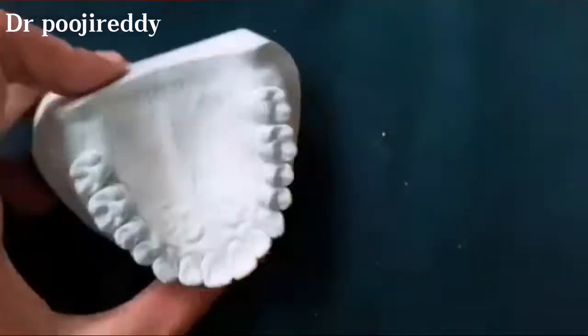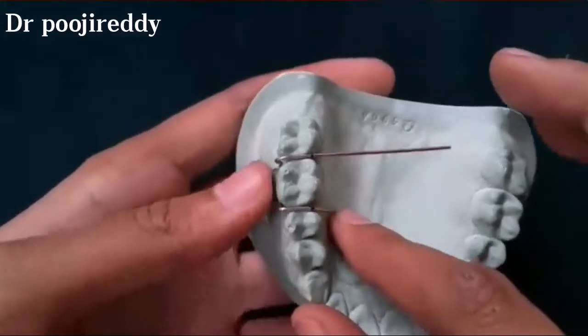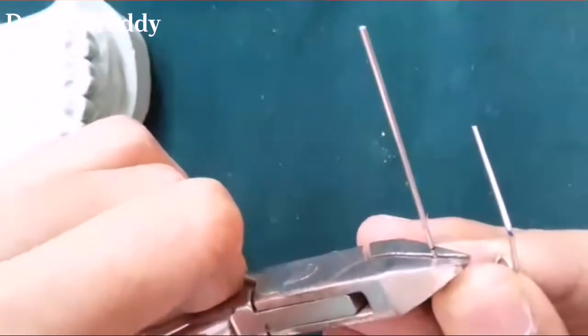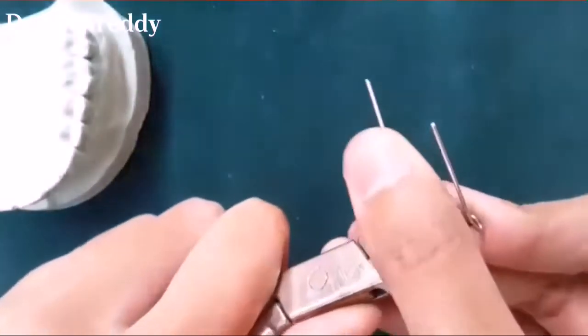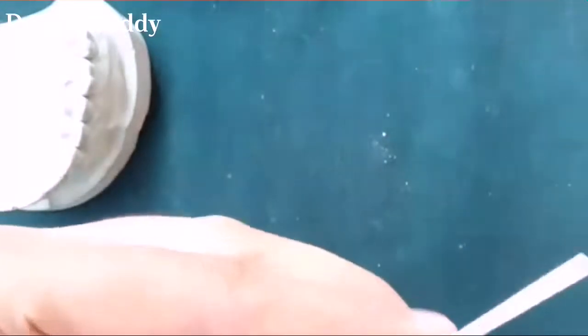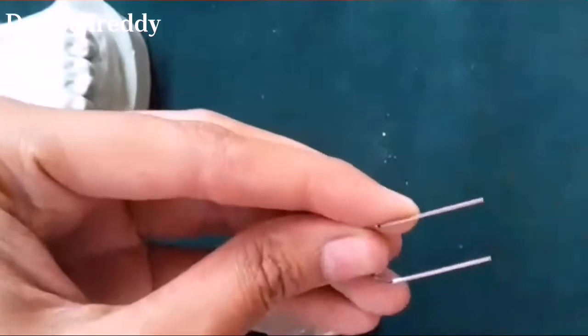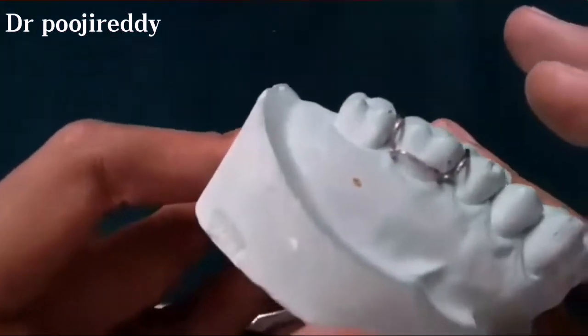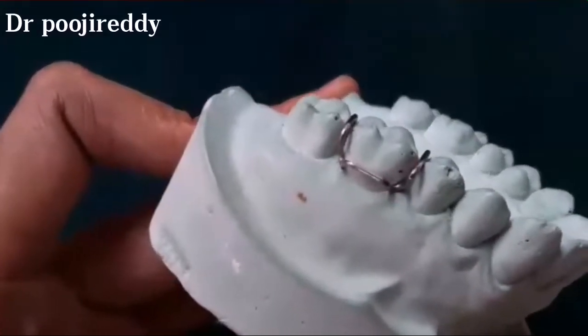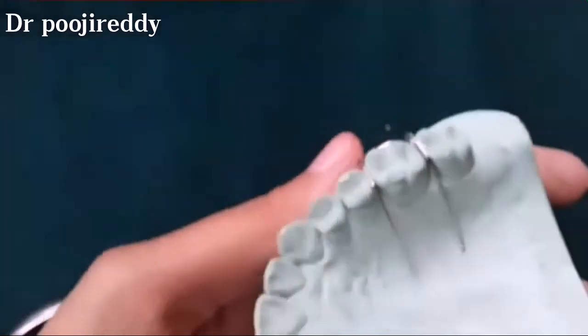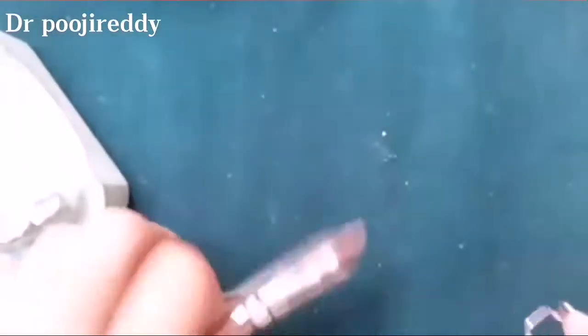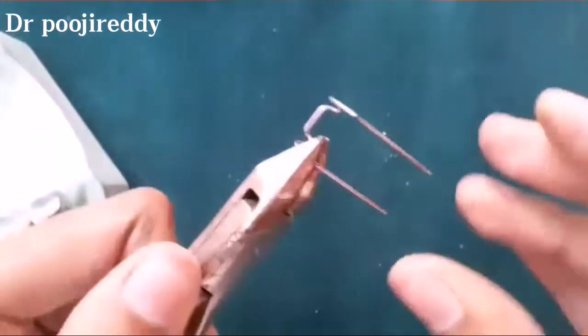And in the same way start bending on the other side. Now I am bending the distal side of the tag arm. Cut the extra wire, adjust it to the cast, and make some final adjustments.